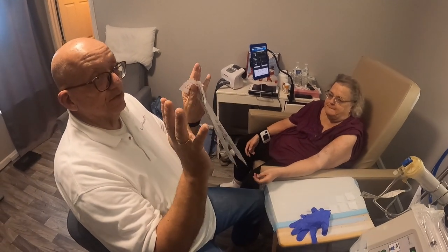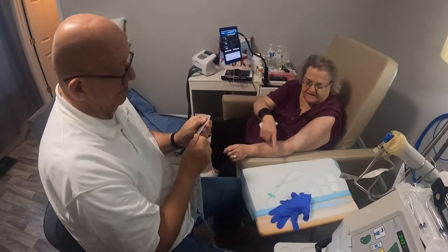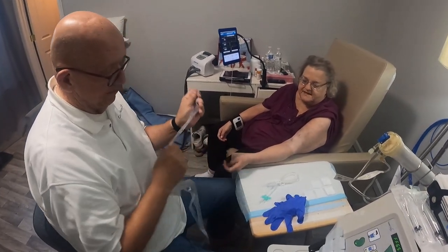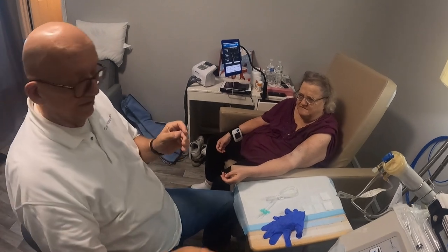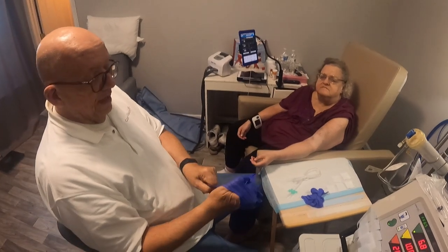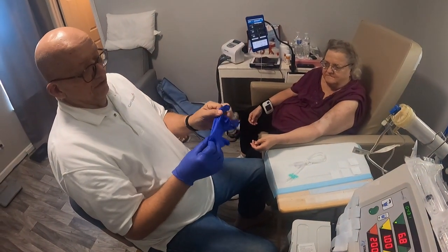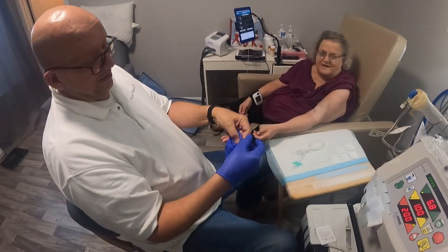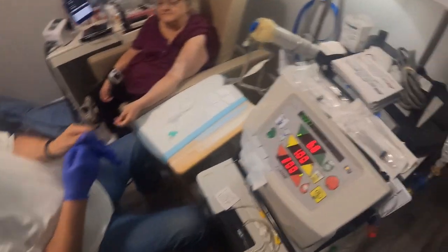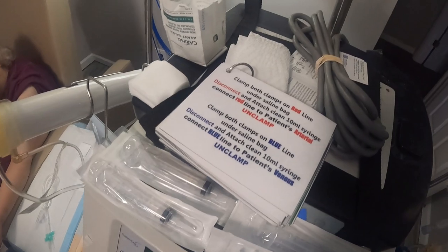So I'm going to tear this open with no gloves on. Because everything in here is covered. The needles have caps on them. Anything that's going to touch my skin is covered when you pull it out. But you figure this is all dirty, for packing. Now where it says sanitize your hands, I've already washed my hands. So I put these gloves on. Then I skipped that page because he always did that. There are instructions here.